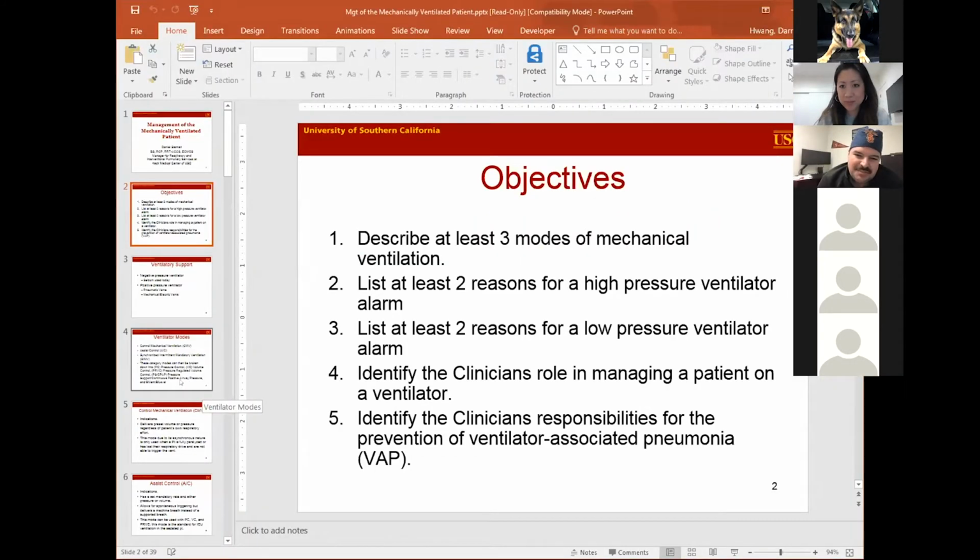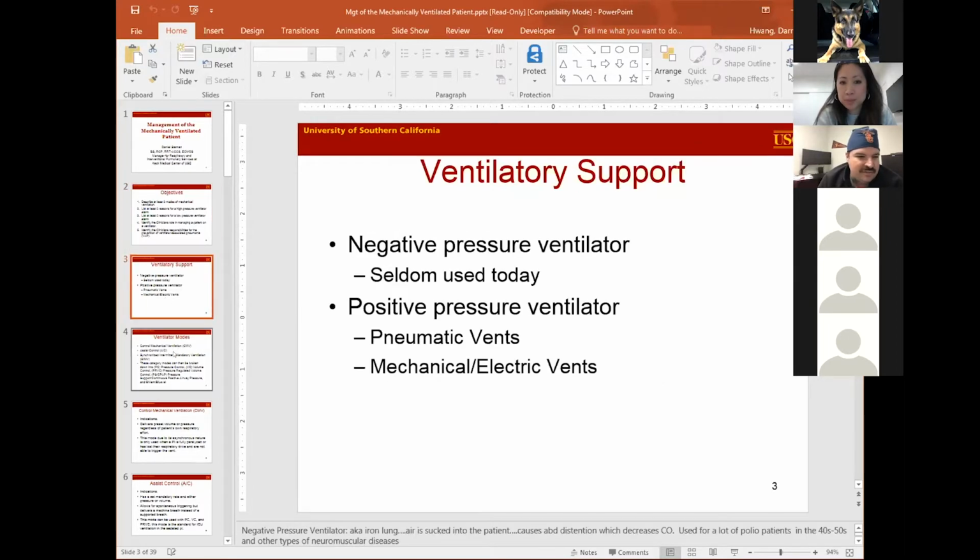So to summarize, we have this COVID problem. It causes a pneumonia. It causes an increased need for oxygen. And one of the key components in mechanical ventilation in terms of therapies is to use higher pressures in the lung to increase surface area of the lung, as well as reduce the oxygen membrane barrier, providing pathways for increased oxygenation and decreased shunting. Go ahead and move to the next screen.